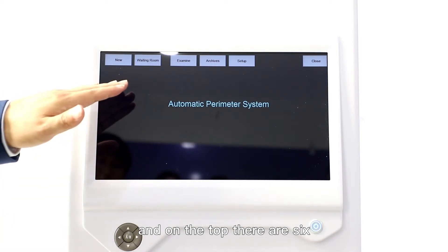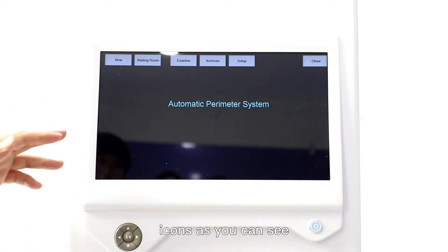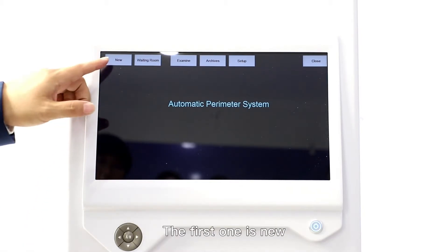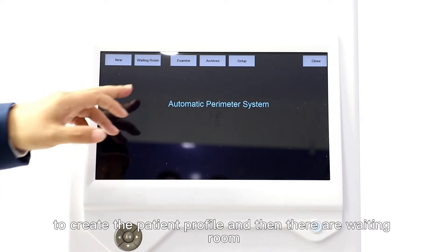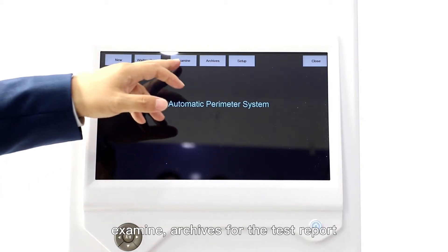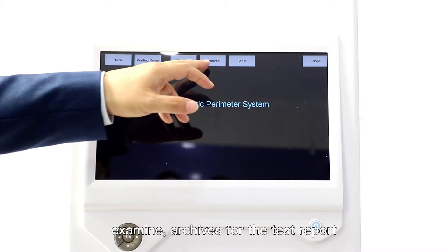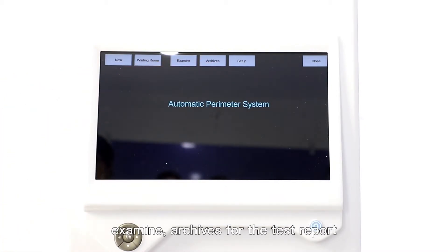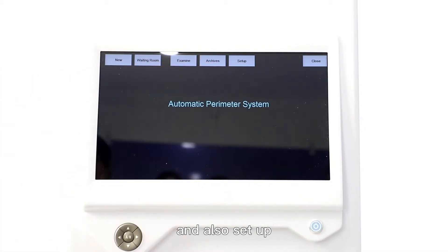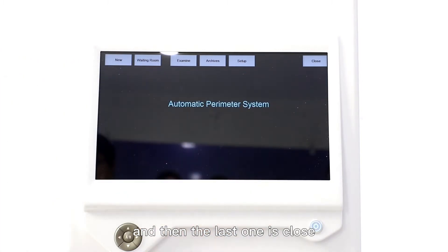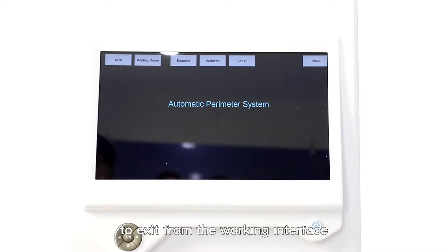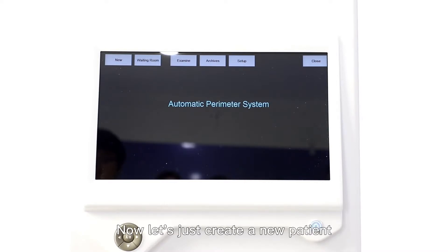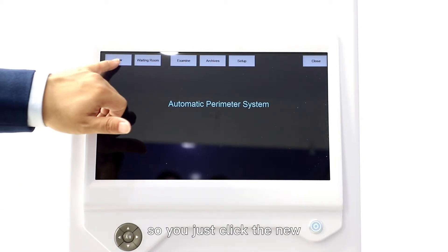We enter into the main working interface of the software. On the top there are six icons: the first one is New to create the patient profile, then the Waiting Room, Examine, Archives for the test report, Setup, and the last one is Close to exit from the working interface. Now let's create a new patient, so you just click New.